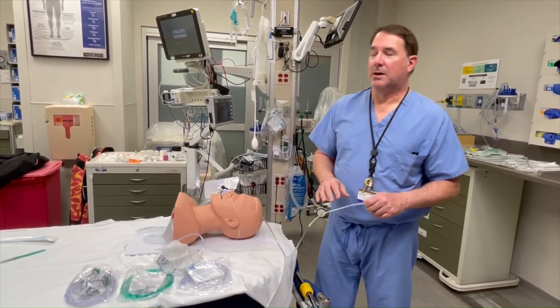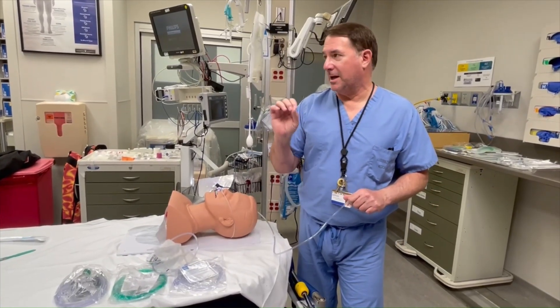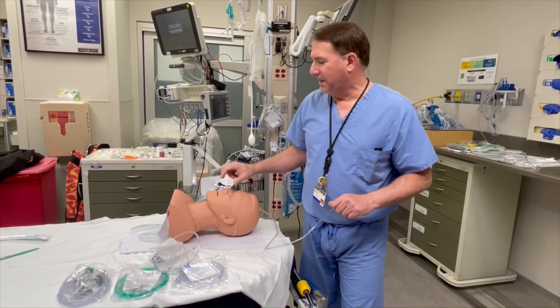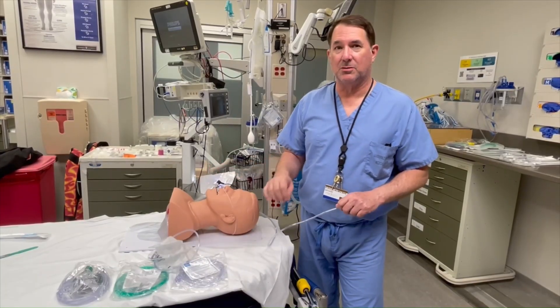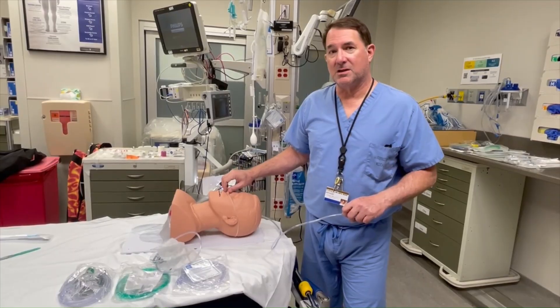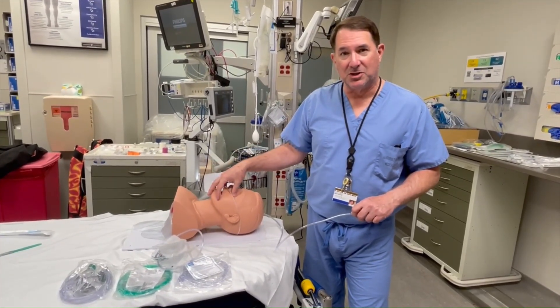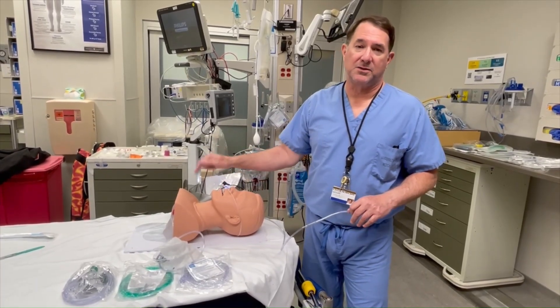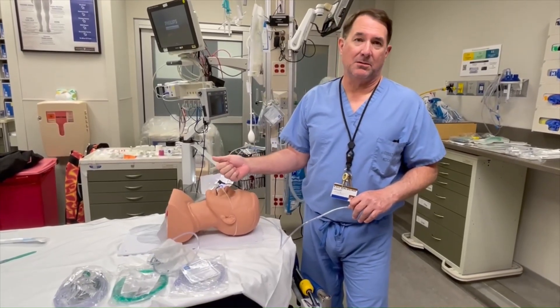You're going to hook it up at a minimum of six liters per minute, but as much as they will tolerate. The cannula stays on throughout the entire procedure until you get the ET tube taped in. This stays on if you're doing bag valve mask ventilation — it should just stay on, period, until you get a cuffed tube below the cords. At the highest rate that the patient will absolutely tolerate.